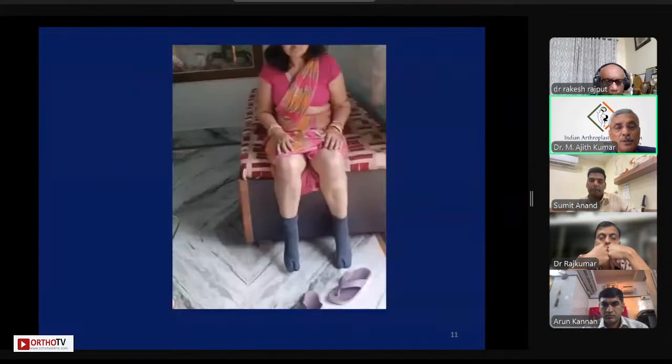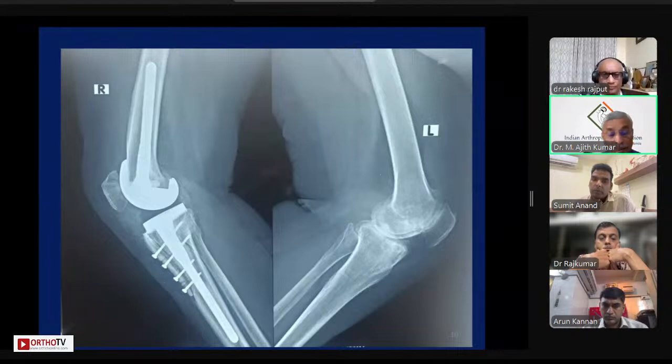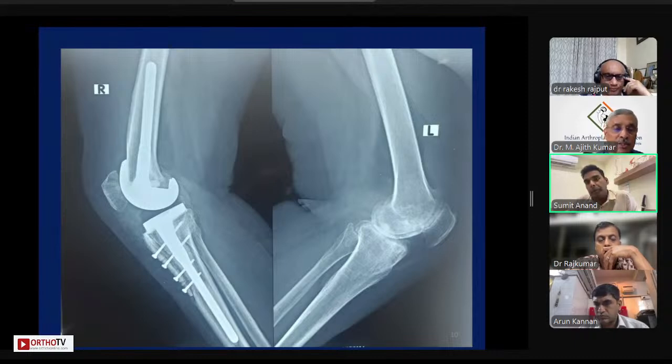Can we go back to your TTO, the lateral view, doctors? See, one of the things is that sometimes this sort of osteotomy pulls up, so the patella gets further up. There is one described technique where, when you take the cut, you create a ledge-like thing, and then you push your osteotomy distal fragment into that so that it doesn't migrate. When you do that, you can just get away with sutures or even wires. You don't have to use so many screws as well.